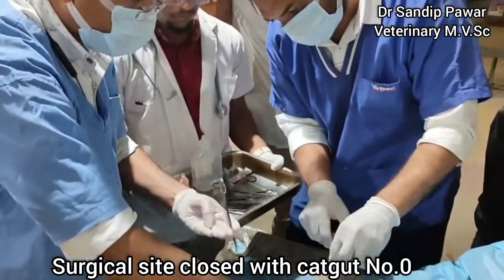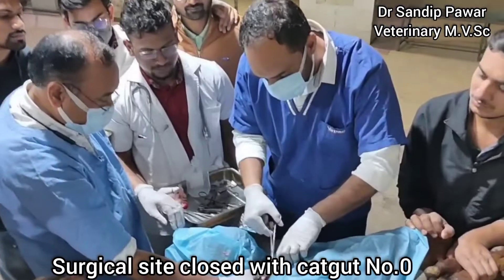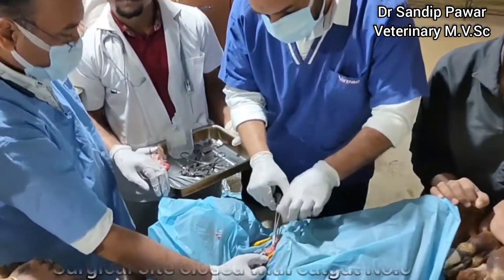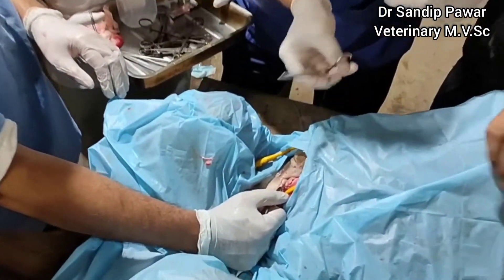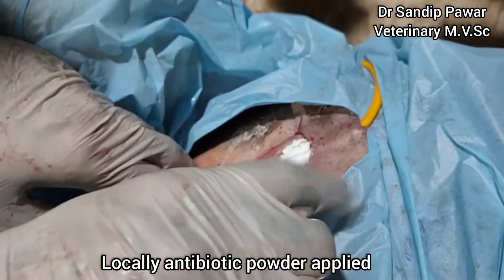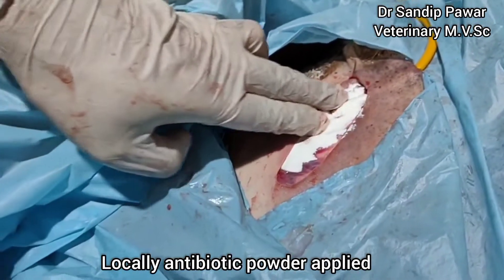Then, at the suture site, antibiotic powder — dicrysticine — was applied locally.